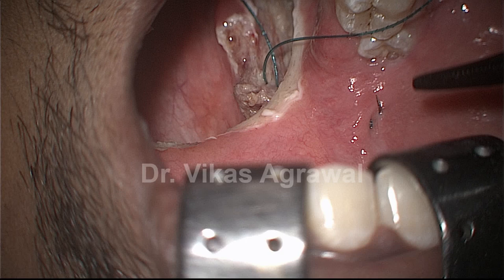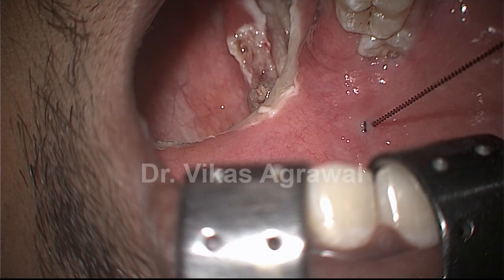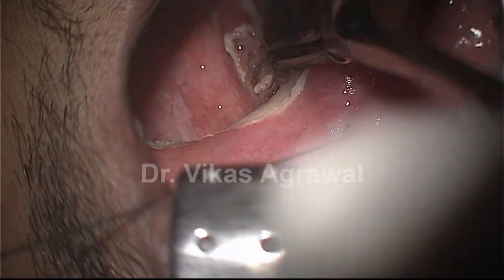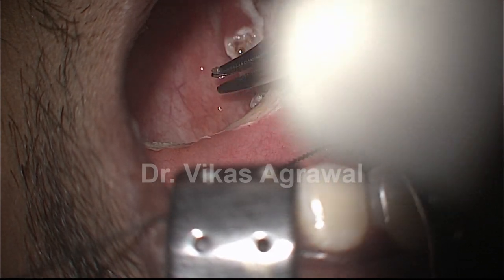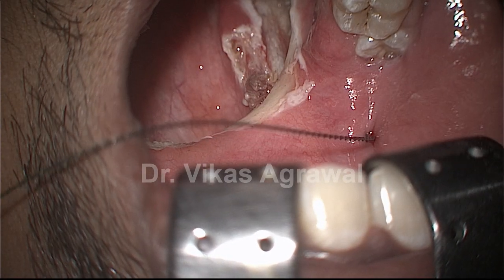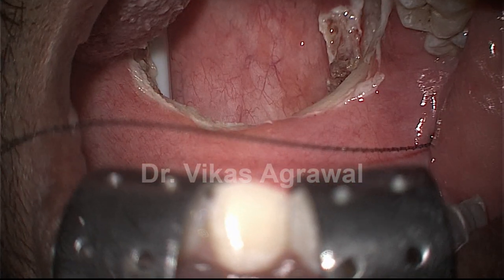This forms the lateral leg of our surgery. Now if these fibres are extra I will possibly remove them, but you can see that there is no raw area at the junctional area. This pulls the soft palate laterally.